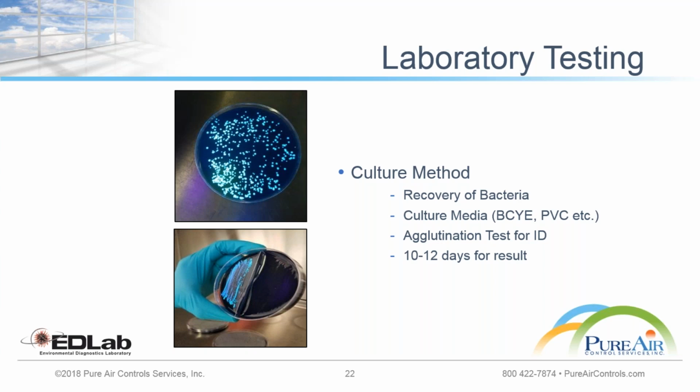The only limitation of this test is that it takes a little longer, about 10 to 12 days. There are various protocols known, and a little standardization, such as the CDC method. The ISO also recommends a method for culture. So there are currently two methods being practiced: one, in short form, is called the CDC method, and the other is the ISO method.